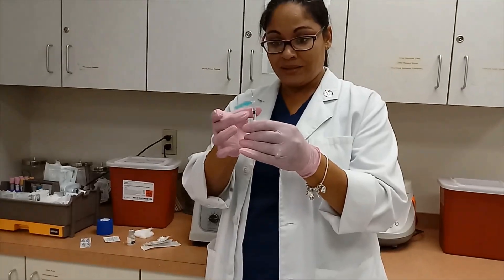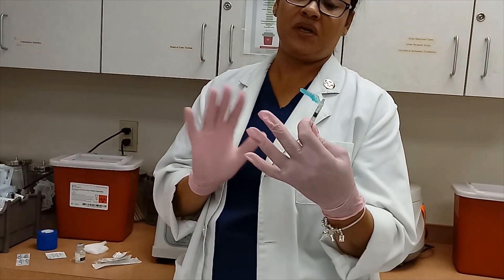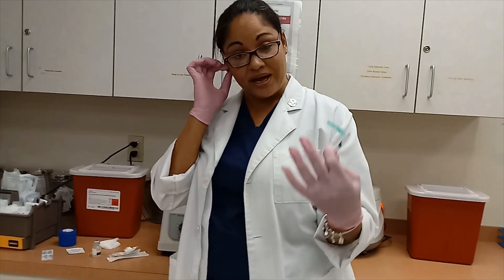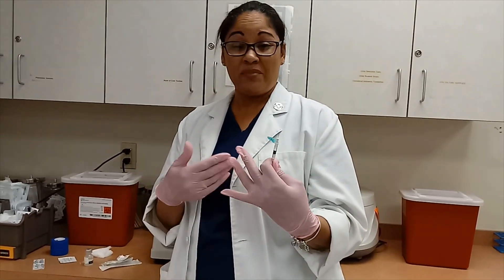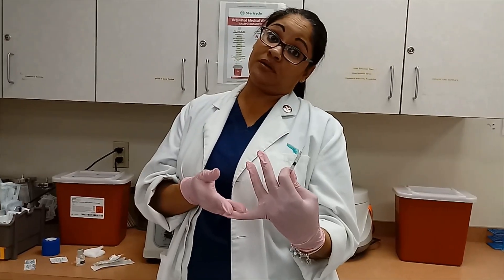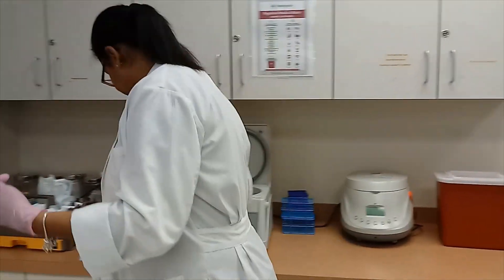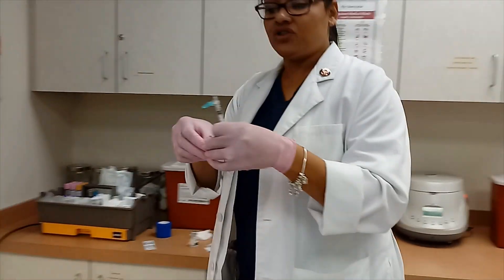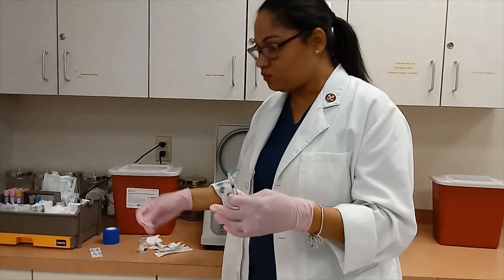When you get back, we will talk about the sizes of the induration — that means if the patient has a reaction, a raised red mark on the arm. That's an induration, and the measurement of that depends on level of exposure. The doctor is usually involved in all that. Your job is to make sure that you place the PPD correctly — that is number one.